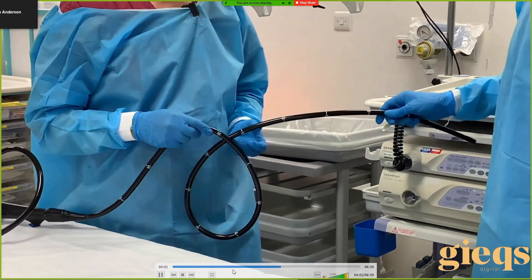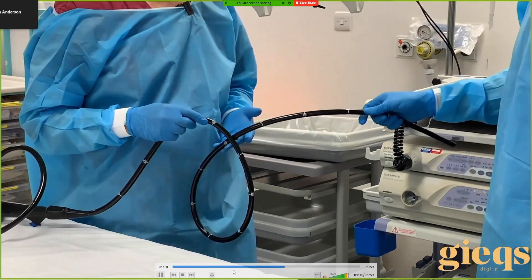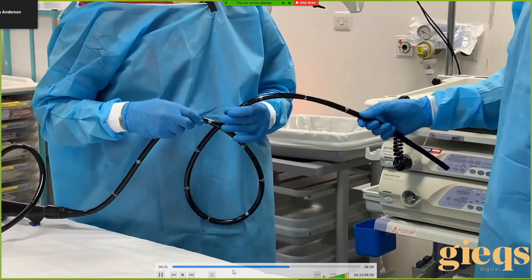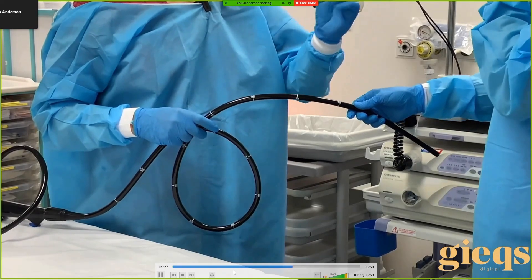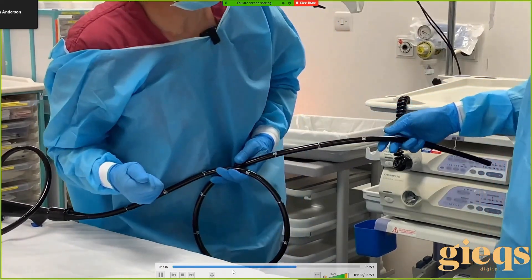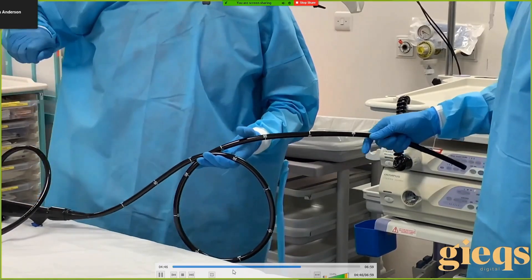If you apply the correct torque the scope wants to move the other way — it lengthens. To accommodate the lengthening you move your right hand back, and at the same time the tip moves forward. So with incorrect torque: it gets harder, the scope shortens, the tip sometimes comes back, and you end up leaning forward into a fist grip. When I see trainees doing this, it's going the wrong way. The body position tells me that.